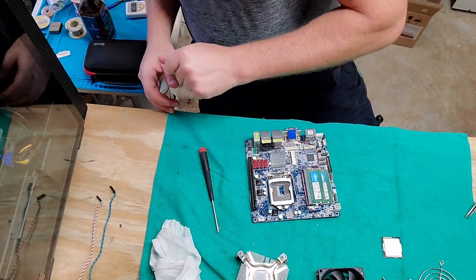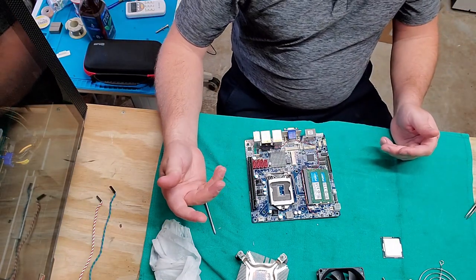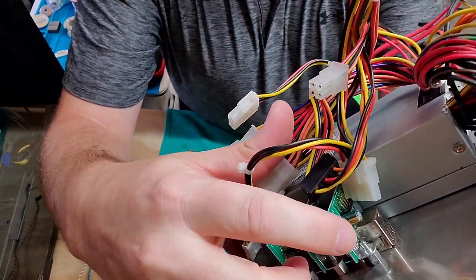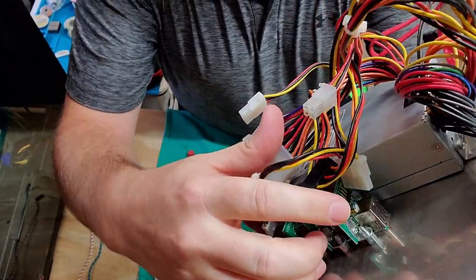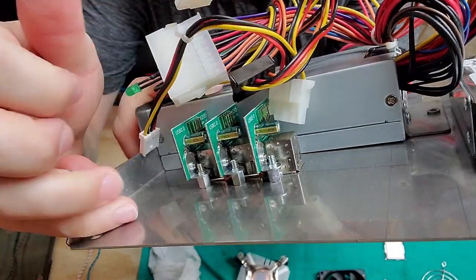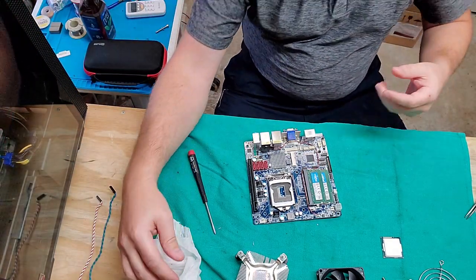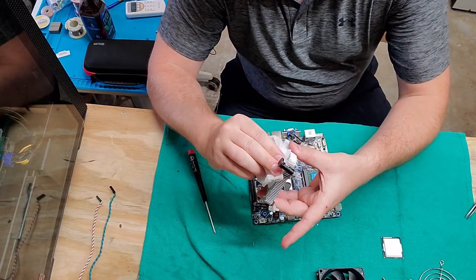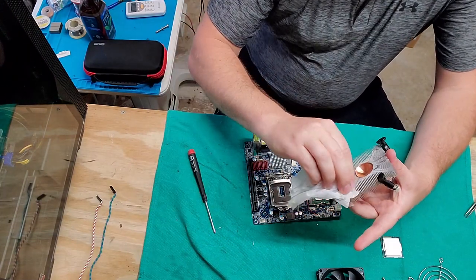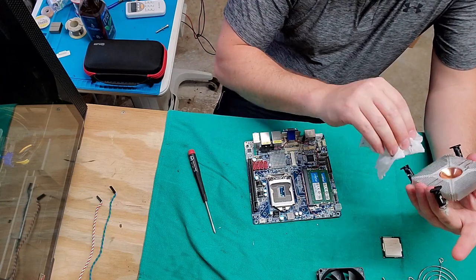The capacitors that normally go bad are electrolytics. And I don't have any electrolytics here. Or do I? Yes, I do. So the type of electrolytics that normally go bad are these ones right here. You see the green one? And you can see the top of it, how it's got the little X over it. That is normally the type of capacitor that goes bad. And at anywhere from 6 to 10 years, whenever I have a computer that's starting to have problems, I immediately open it up and you will see these capacitors just all around the CPU socket and they start to go bad. But this one here looks like it's a higher quality motherboard. It's got better capacitors on it.